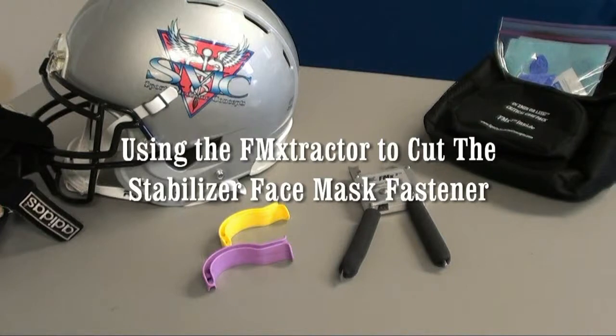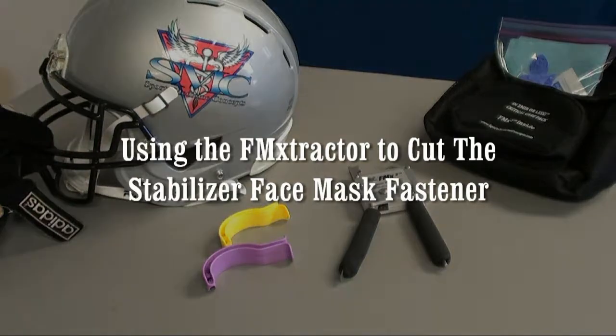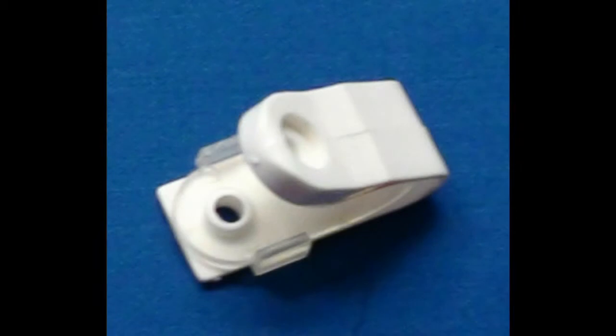Welcome to Sports Medicine Concepts Educational Series addressing specific use of the FM Extractor on various football helmets and fasteners. In this segment, we will be reviewing face mask removal from football helmets retrofitted with shock blocker face mask fasteners.